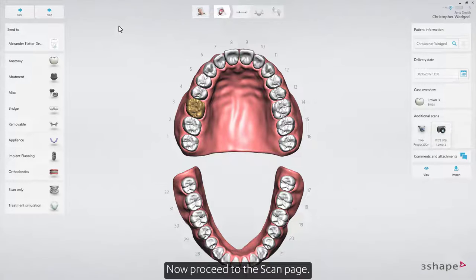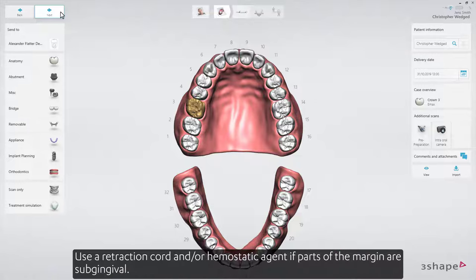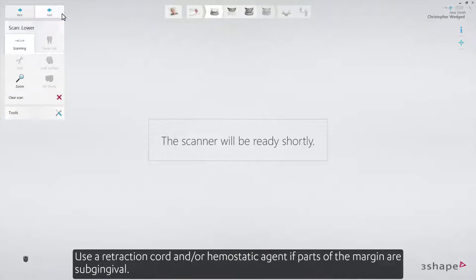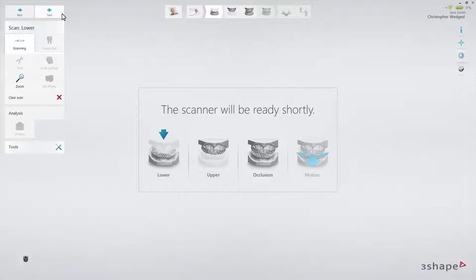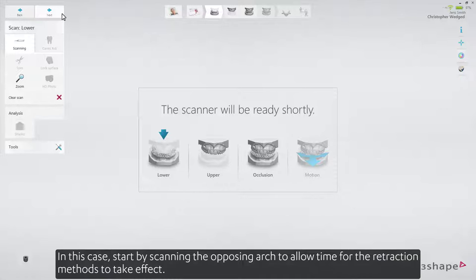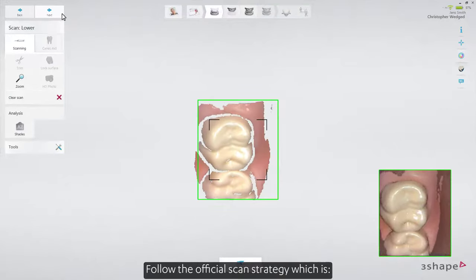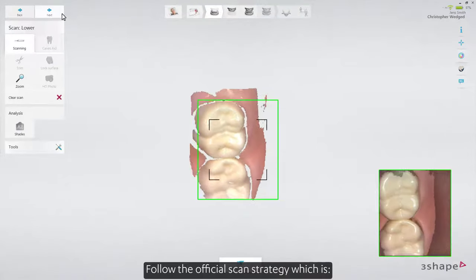Now proceed to the scan page. Use a retraction cord and/or hemostatic agent if parts of the margin are subgingival. In this case, start by scanning the opposing arch to allow time for the retraction methods to take effect.